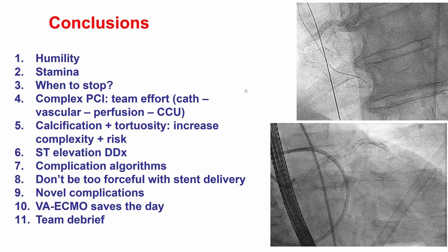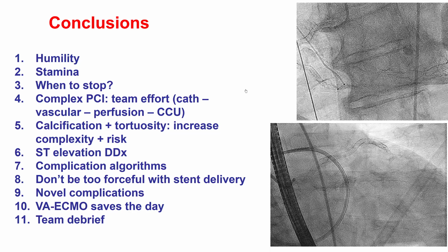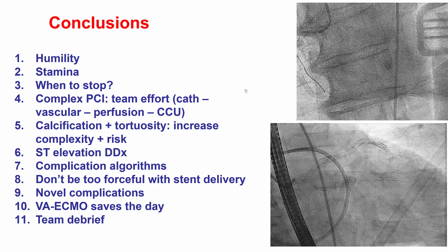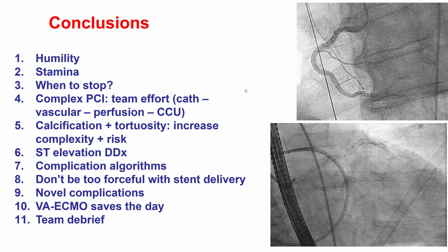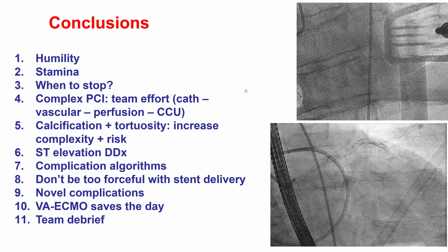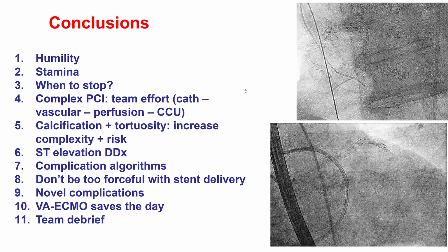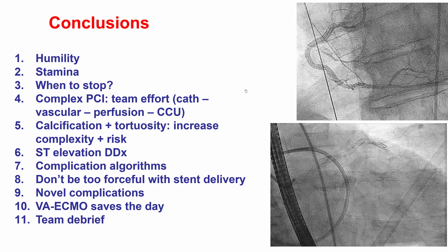Another lesson is the importance of not pushing stents too much when there's difficulty delivering. About 2 of the hours of the case were actually spent trying to recover from the stent loss that happened in the right coronary artery, and that made everything very challenging with subsequent equipment delivery.